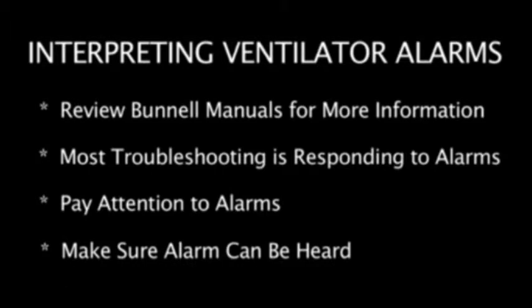And second, make sure that the alarm volume is loud enough to present a sense of urgency when it sounds. If it's turned down too low, you may not even hear it. You cannot turn the alarm volume all the way off. You can, however, turn it down to a level that I think might be a little bit too low in a busy newborn intensive care unit.